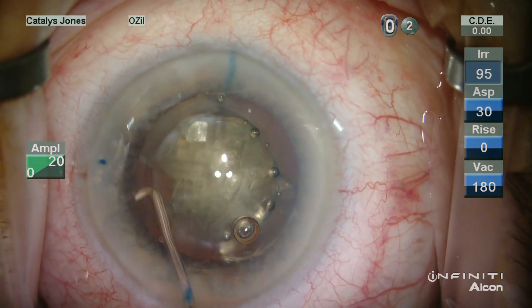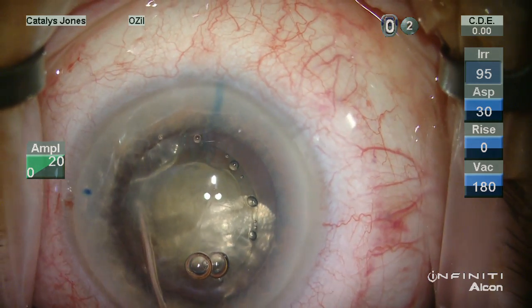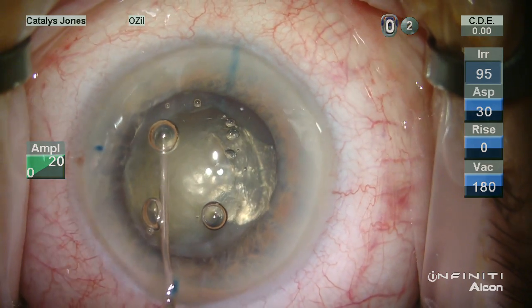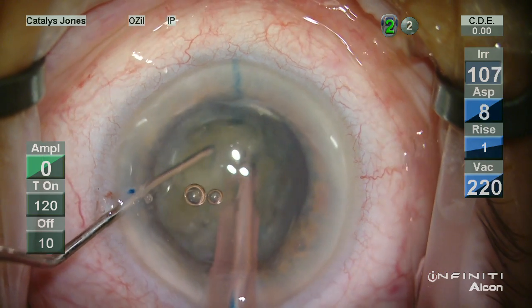Hydrodissection is important as it is in any case. However, with pseudoexfoliation, we want to be paying particular attention to capsular movements, especially during hydrodissection, as well as achieving a good rotation — which we do.